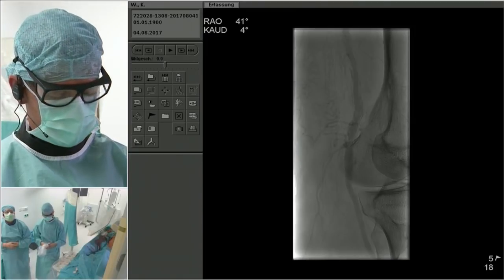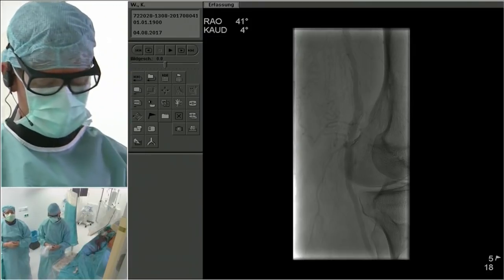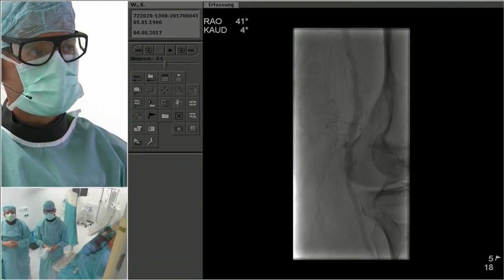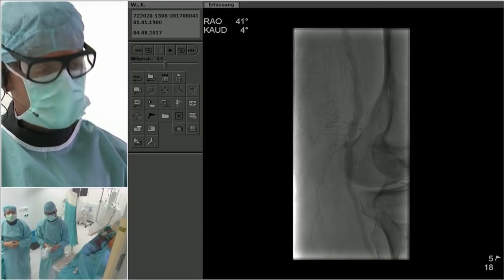Andrej, I hope you heard that. Can you tell us what your approach is now, once we have failed to cross antegrade? Are you going to go anterior tibial right away, retrograde?